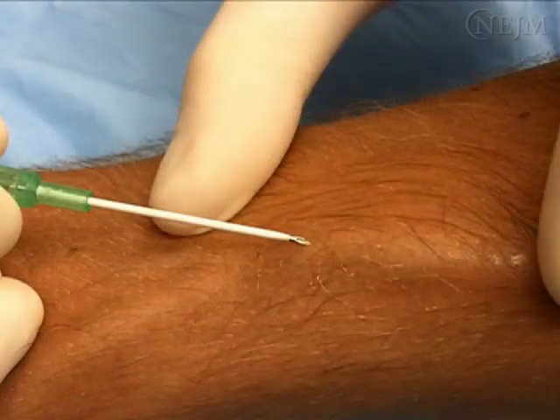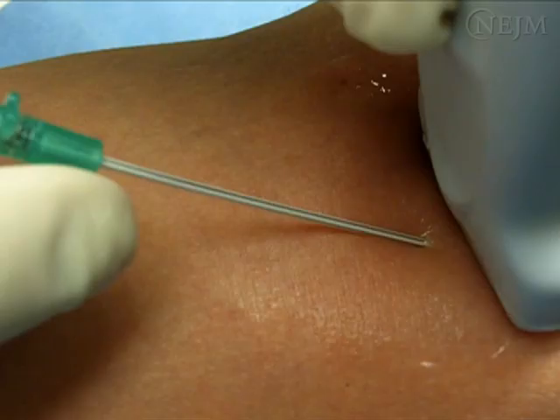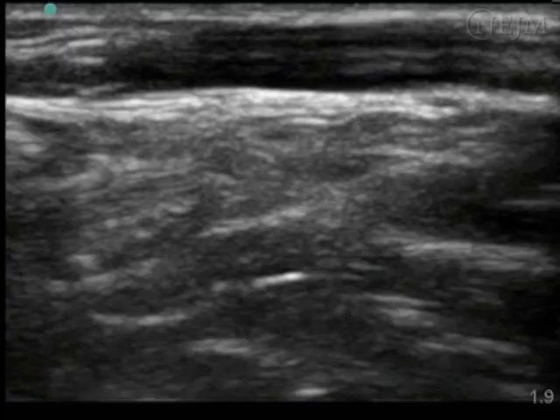Providers who are proficient at standard IV catheter placement will find it relatively easy to learn ultrasound-guided techniques. Novices need to understand a few basic ultrasound concepts. Ultrasound images are created by reflections of sound waves, so denser structures appear bright and fluid-filled structures appear dark.